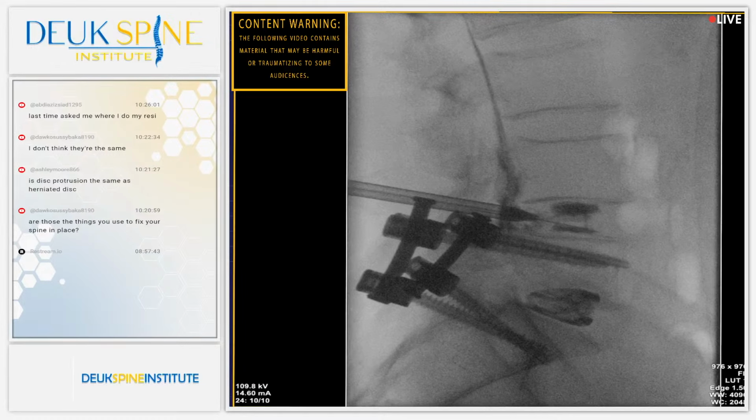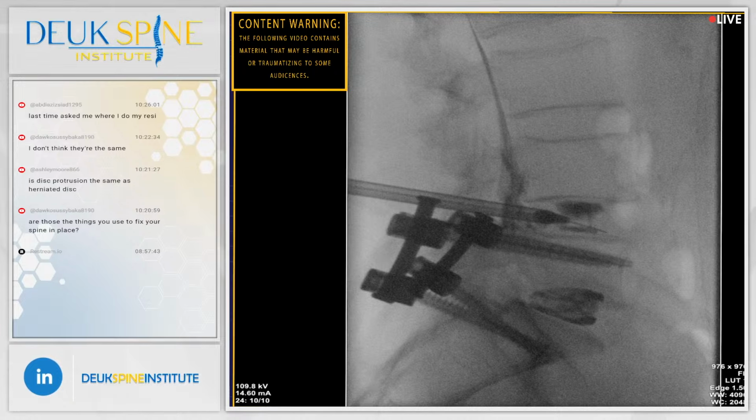Before we show you another video on how the annular tear causes so much back pain, we'll take a few questions. We have a question from a YouTube user. Are those the things you use to fix your spine in place?